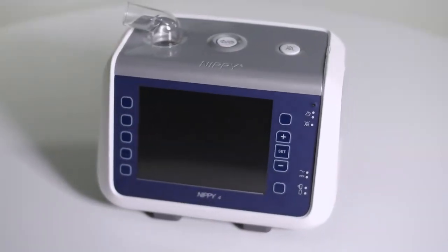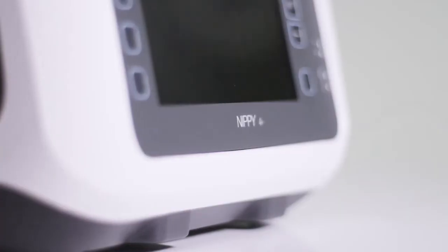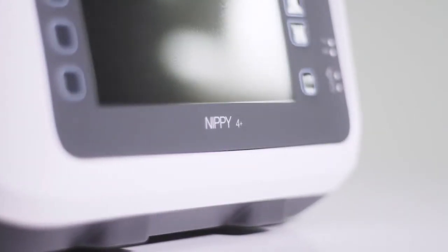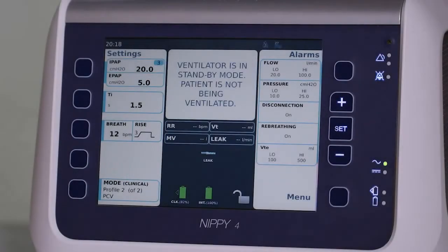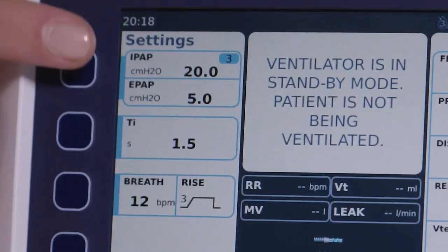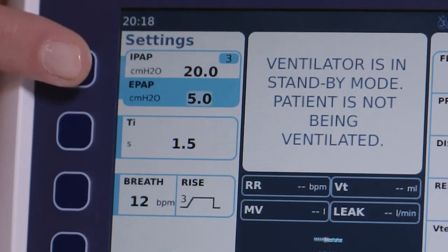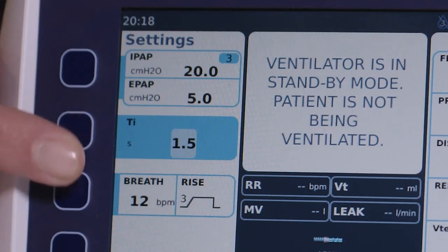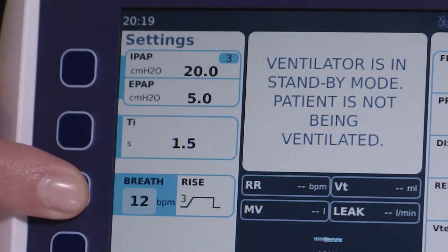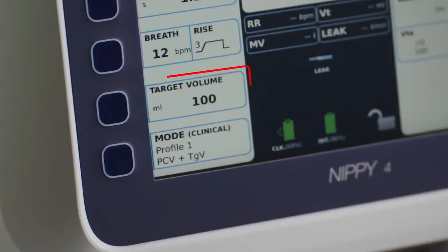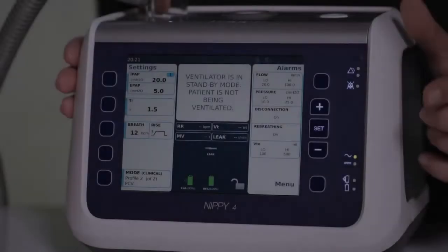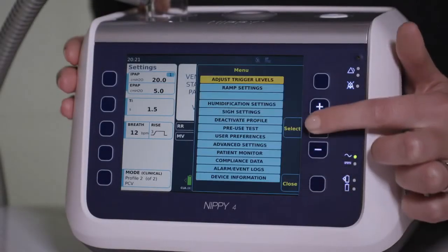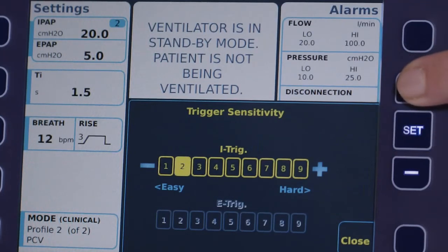Once you have selected a treatment profile and mode, the interface is easy to use and consistent with the legacy NIPI ventilators. The following clinical parameters are listed down the left side of the screen: treatment pressures IPAP and EPAP, inspiratory time settings, backup breath rate and rise time, and target volume if in an appropriate mode. Patient trigger settings can be accessed via the first option in the main menu and appear next to the IPAP and EPAP settings.